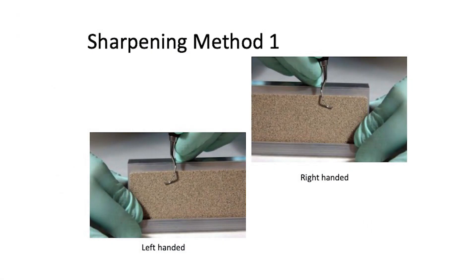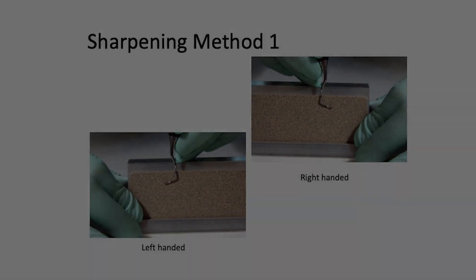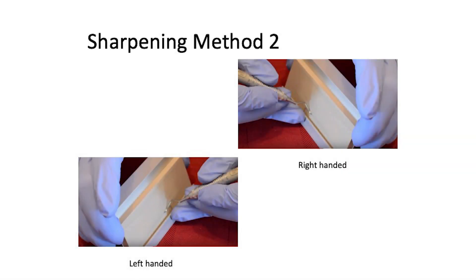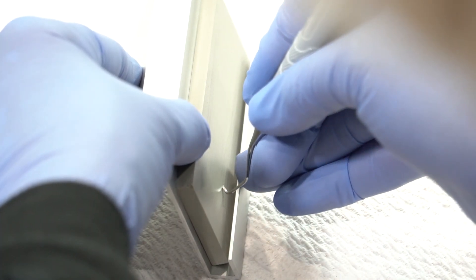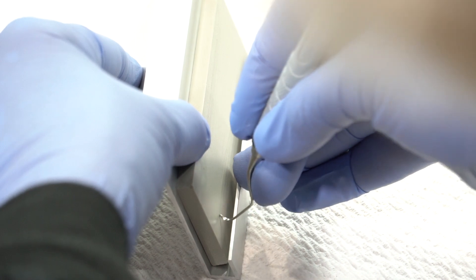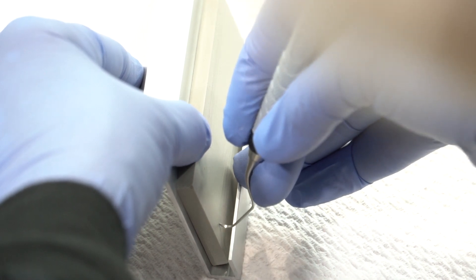There are three different methods. Method one is where you fulcrum up on the beam of the sharpening horse. Method two is where you fulcrum on the leg of the sharpening horse. Again, keeping the face parallel to the tabletop, starting at the heel third, the middle third, the toe third, and the toe, keeping the face parallel.